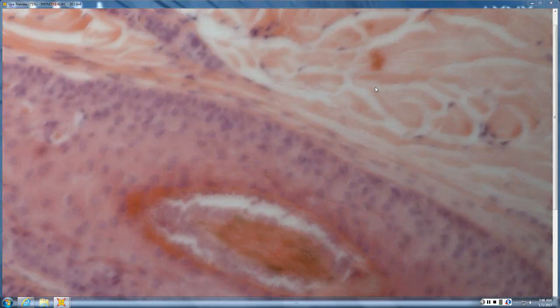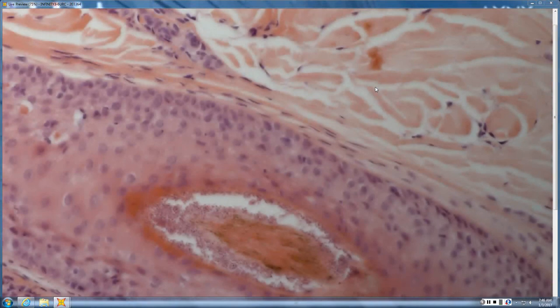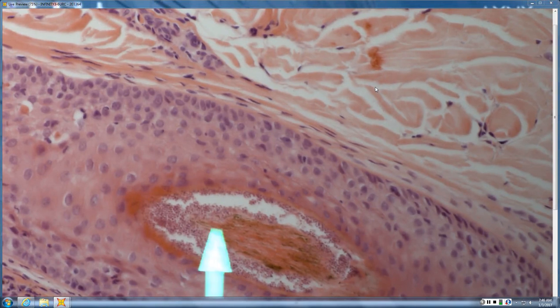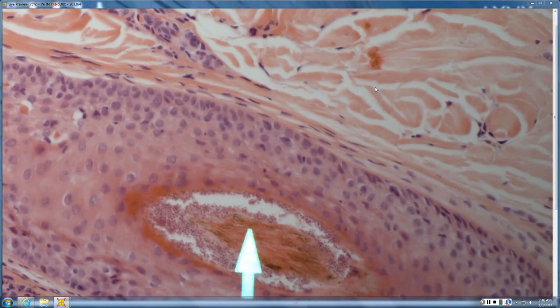On the same level. Let's see if I can index on this area. Like a tinea, and I'd say probably more like ecto. This is all around the outside. Yeah. Although there is some invasion of the hair follicle. So tinea or Majocchi's granuloma would look the same. And there's rarely any granuloma in Majocchi's granuloma, despite the name.